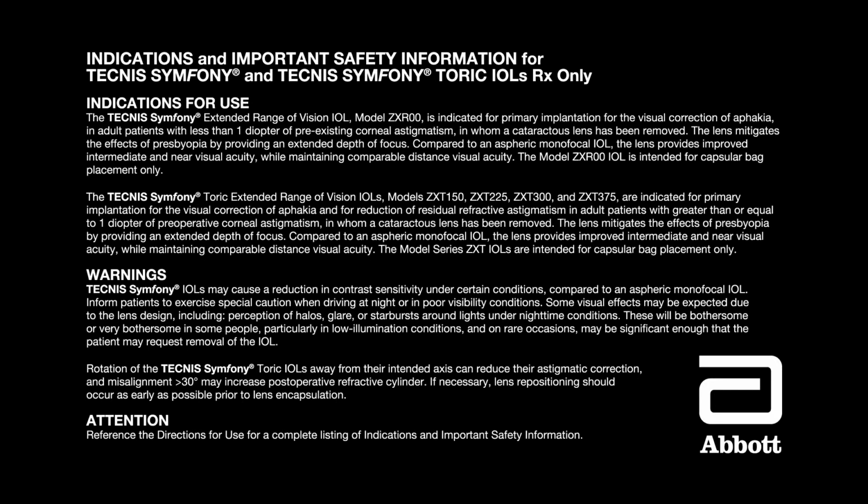Rotation of the Tecnis Symfony Toric IOLs away from their intended axis can reduce their astigmatic correction, and misalignment greater than 30 degrees may increase postoperative refractive cylinder. If necessary, lens repositioning should occur as early as possible prior to lens encapsulation. Attention! Reference the directions for use for a complete listing of indications and important safety information.